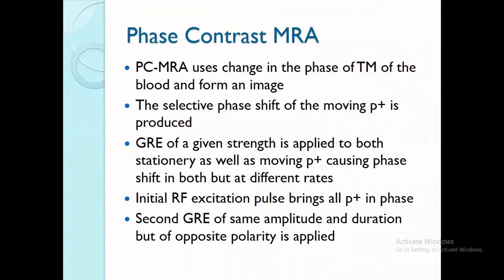So while proceeding to our first topic, which is phase contrast magnetic resonance angiography, by phase contrast means that there will be a change in the phase. Change in the phase means that we are having two things. One is called the frequency and the other is called the phase. We are always playing with these two things. So in this technique, we will be playing with the phase. If you bring a difference in the phase, so bringing difference between the two things can give us the contrast difference. So that's how we mean here, phase contrast MRA.